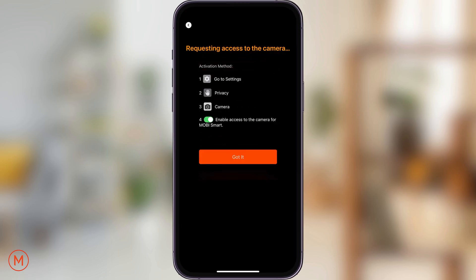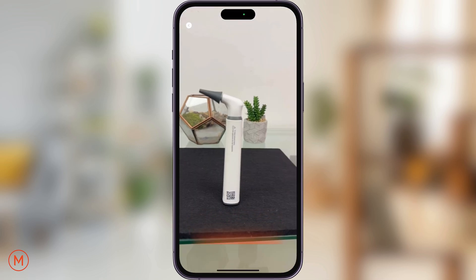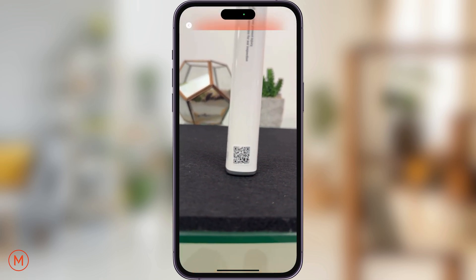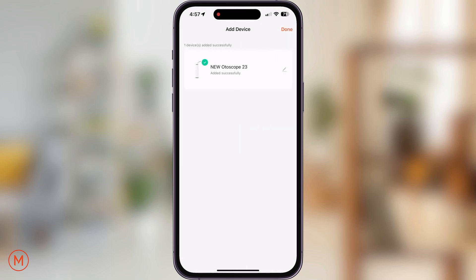Please allow the Mobi Smart app to have access to the smartphone's camera. After doing so, point your smartphone's camera in front of the Autoscope's QR code. Once connected, hit done on the top right corner.